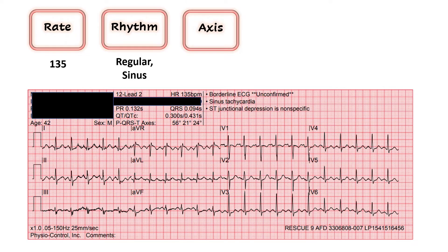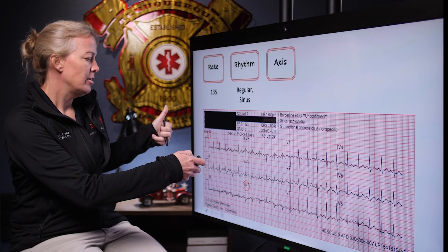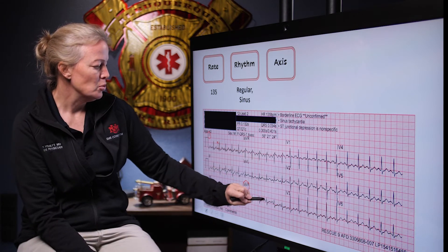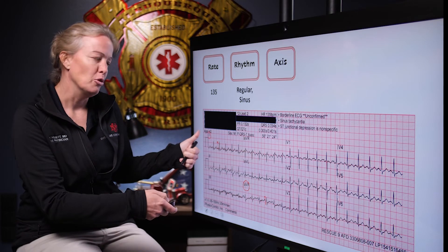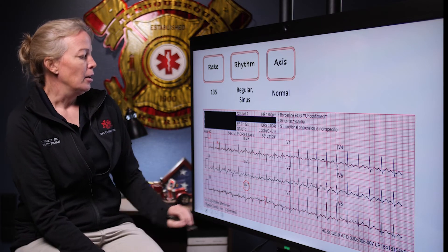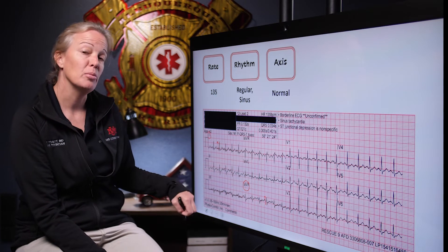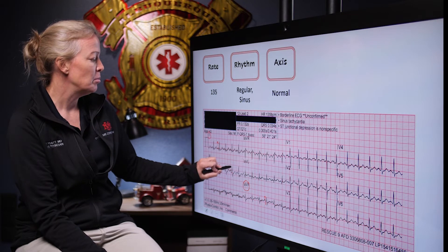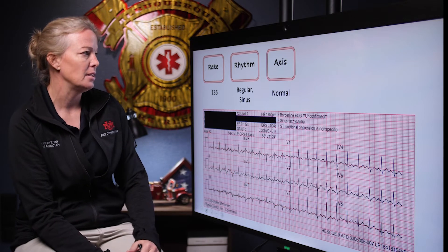Next we look at axis, using lead one and lead AVF. The QRS vector is mostly up in lead one, so our left thumb is up. AVF is kind of isoelectric and questionable, but in general I'd give this a normal axis. You can use lead two as a tiebreaker — if lead two is up, AVF is probably up and the axis is fine. I'll go with normal axis here.